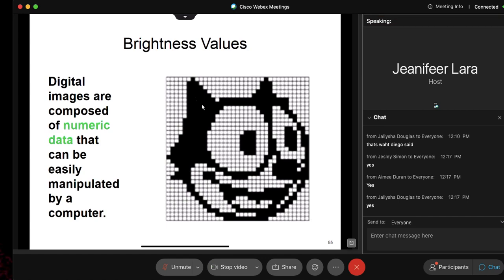It's not a square where you have a cutout of this cat and the x-rays did. It's the opposite, isn't it? This is being transmitted and this is being absorbed. So when you take this into account in x-rays, this material absorbed to give this appearance. Does that make sense? So in your mind, you can think, how was this created? It wasn't a cutout. The square was cut out of thick or high atomic number material, and this was voided. Does that make sense?